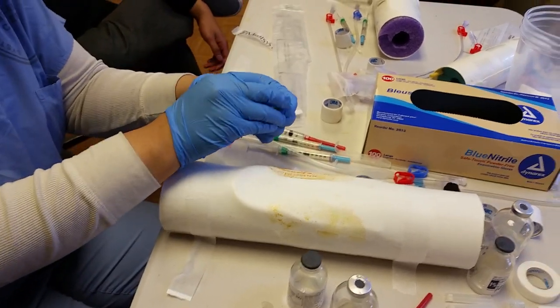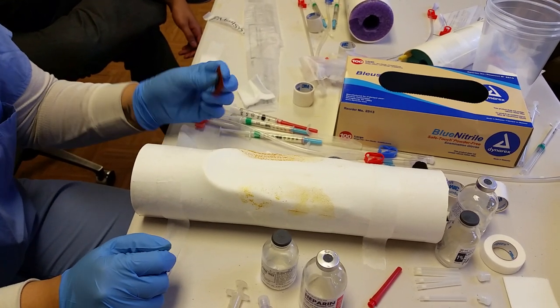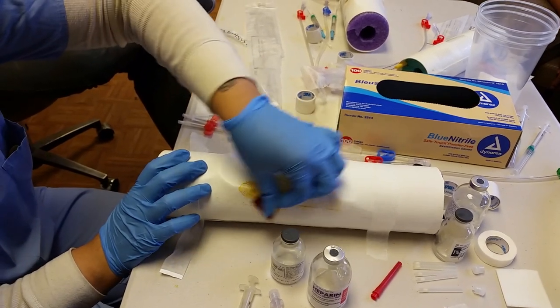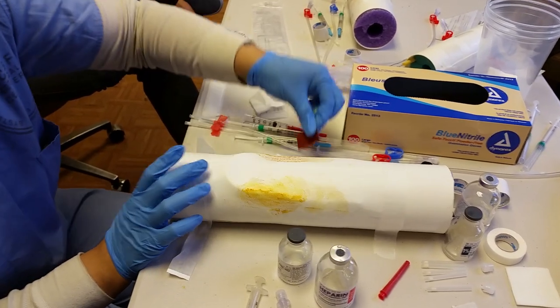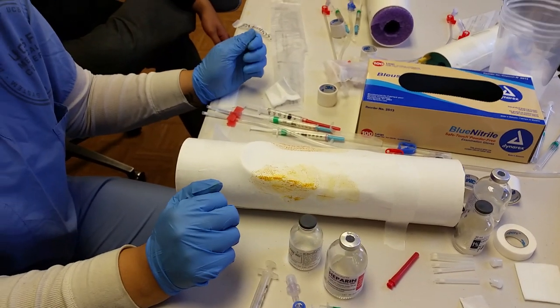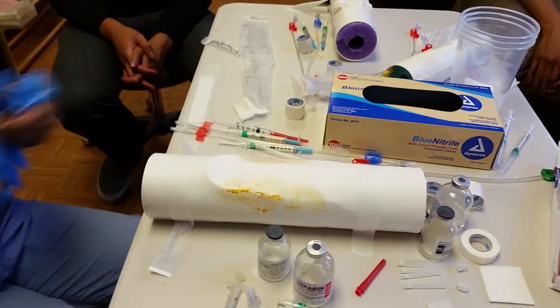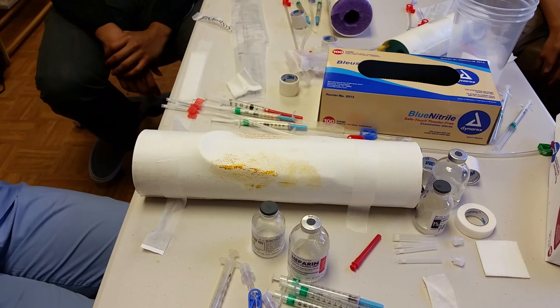Only go in one direction because if you come back you're introducing infection. Since this is a solution that cleans, it should be okay — maybe three or four times, just circular motion. Wait a couple minutes — two to three minutes — to dry. I normally change my gloves at this point. During this time you can get the blood pressure, set up your machine, and get everything ready so when the needles are in you can get them right on.